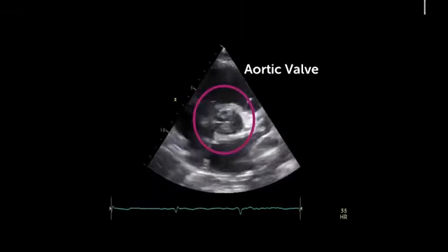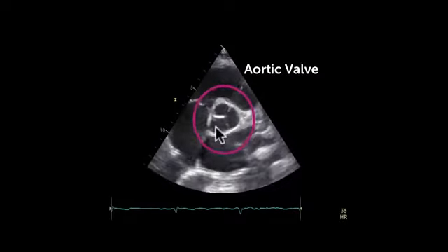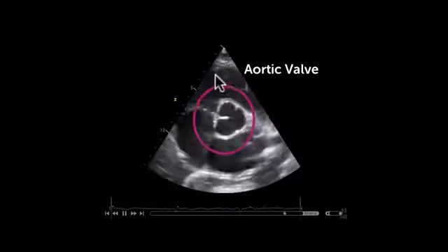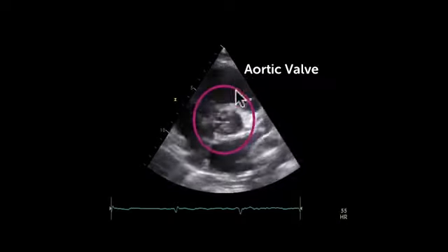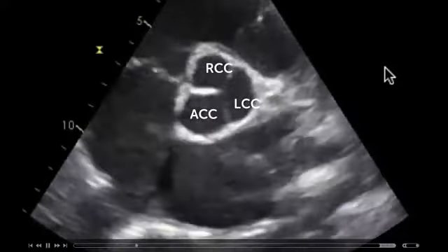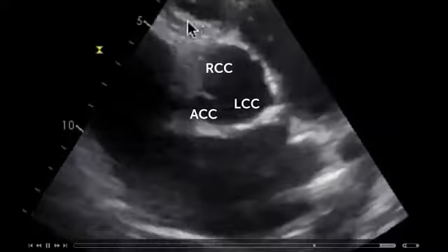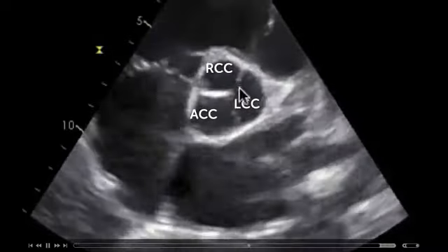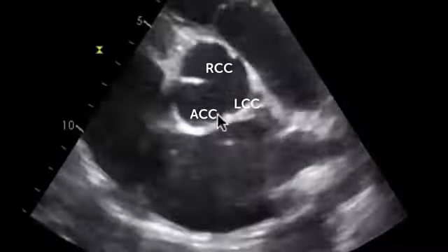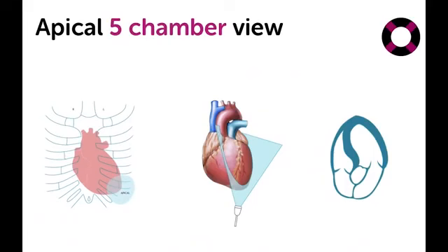For review purposes, again my favorite loop, with the aortic valve in the center, left atrium, interatrial septum, right atrium, tricuspid valve, right ventricle with the right ventricular outflow tract, the pulmonic valve, and the pulmonary artery. For all of you who want to be real geeks with respect to the aortic valve, how can you name the different cusps? Well, the right coronary cusp is always close to the right ventricle. The left coronary cusp always close to the pulmonic valve, while the acoronary cusp is always close to the interatrial septum.